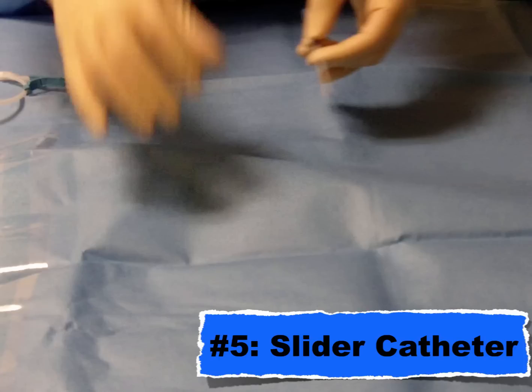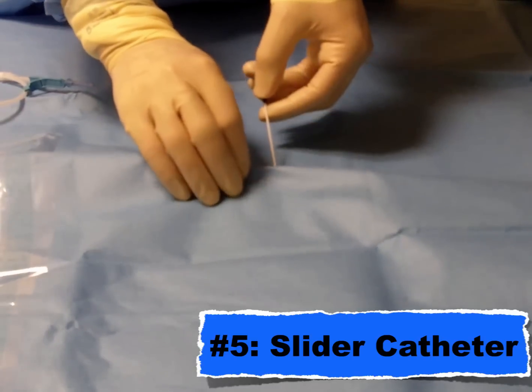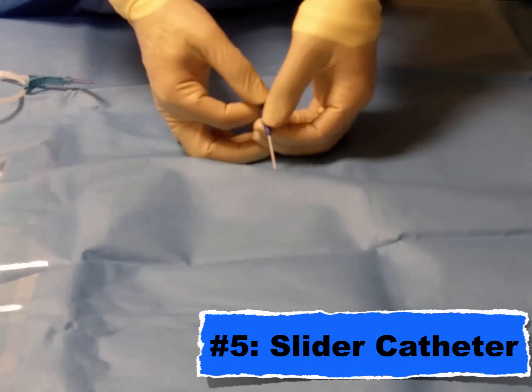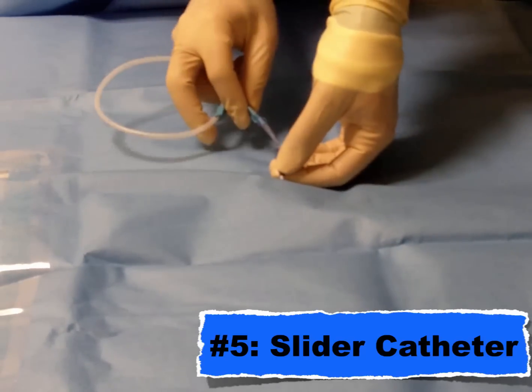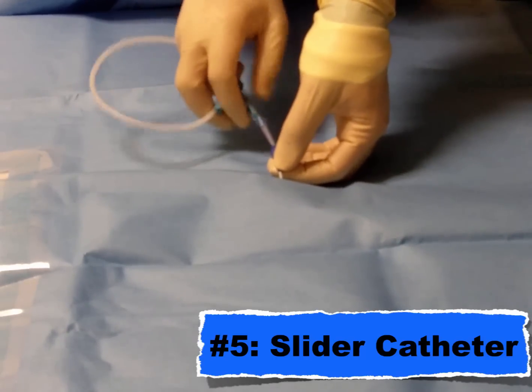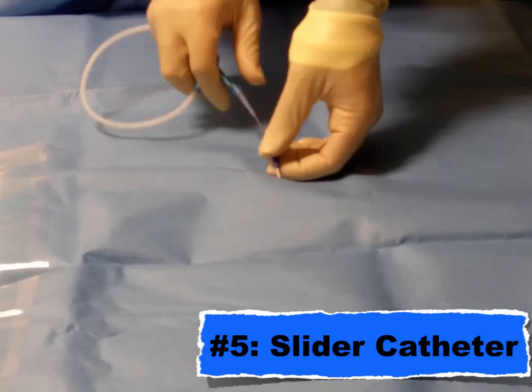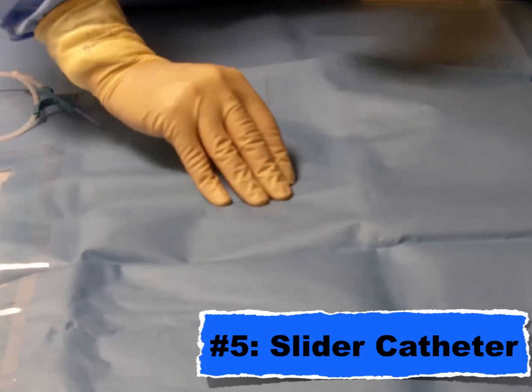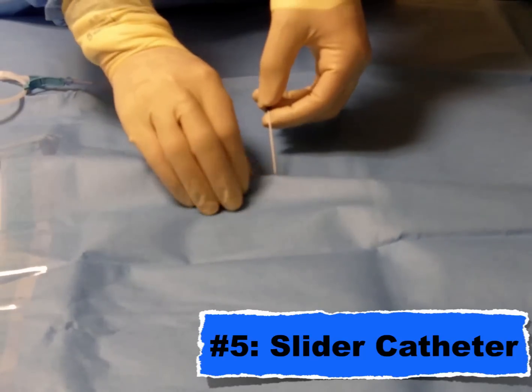I encourage you to look for what I call the slider catheter — that is just a needle with a plastic sheath on top, essentially just an IV. What you're going to do is pop into the vein, get your flash, and then advance that catheter over the needle. Now you have a long catheter inside that central vessel, you can put your wire in and attain vascular access. You don't need as steady of a hand as you did with that steel needle.